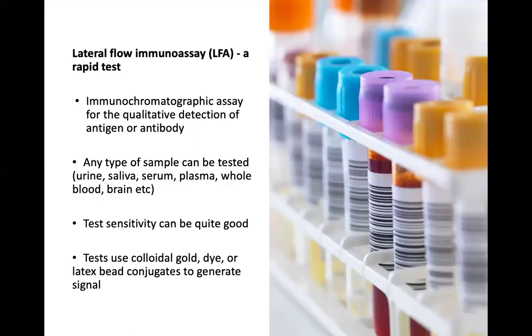The full name is immunochromatographic assay because it looks like a paper chromatography, so it works like paper chromatography, the separations. It's a rapid test because of the time taken for us to have the answer, yes or no. It's not only qualitative, it can be quantitative, depending on how you design the rapid test kit.